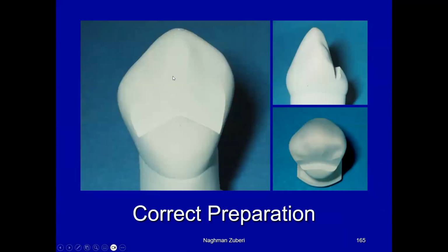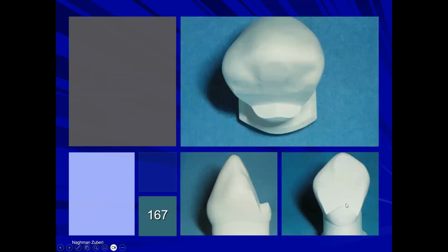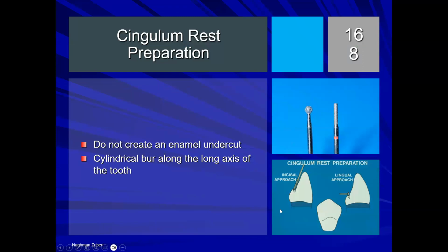This is the correct position. It should not be too low, it should not be too high. This is way too high. And this is way too low. You can use a round head burr to prepare it, or you can use a cylindrical burr, no matter what.